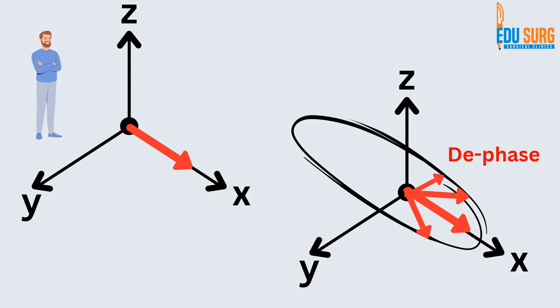Now, when we stop the pulse, after some time, the different ionic hydrogens will reach their resting state at different times. And what has been understood is that water takes a very long time to return back, whereas fat takes less time to return back. And this is the basic concept of doing an MRI.